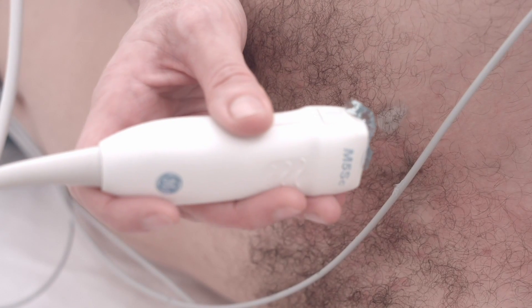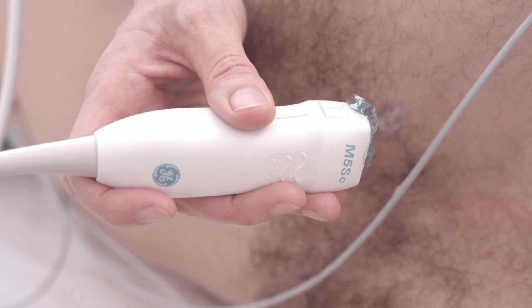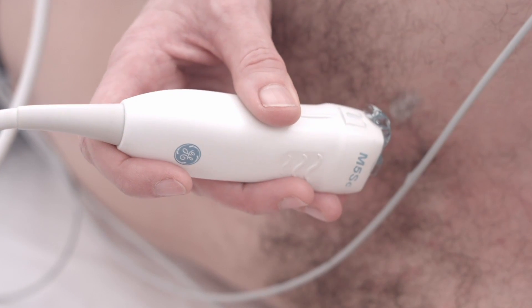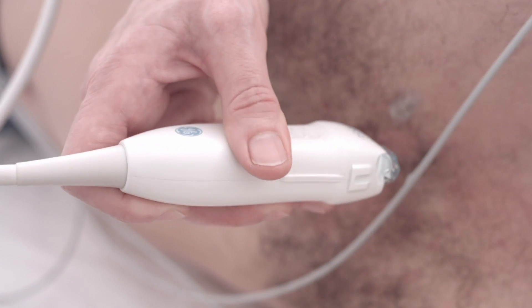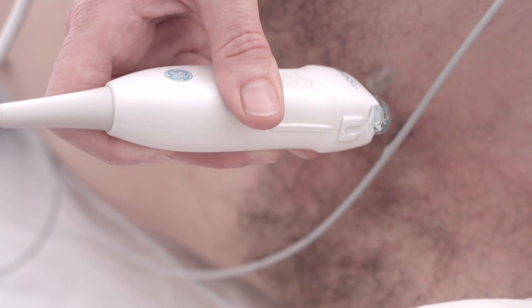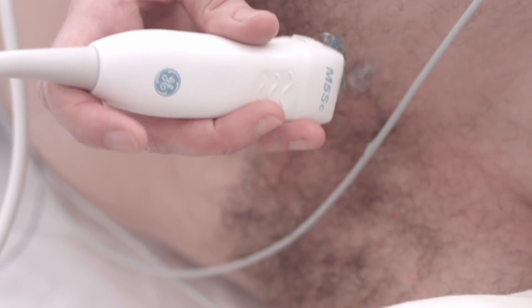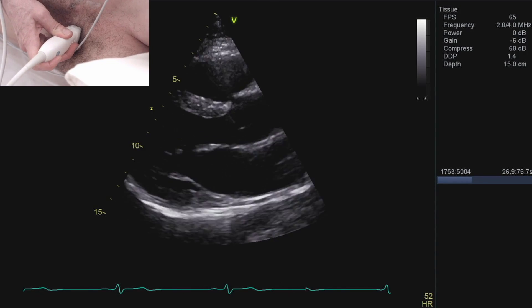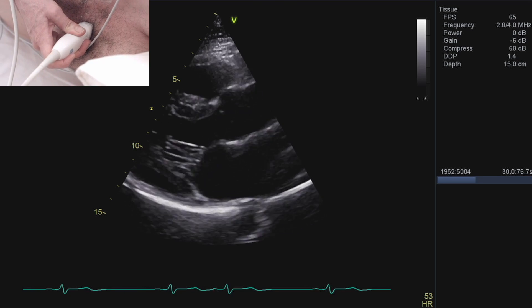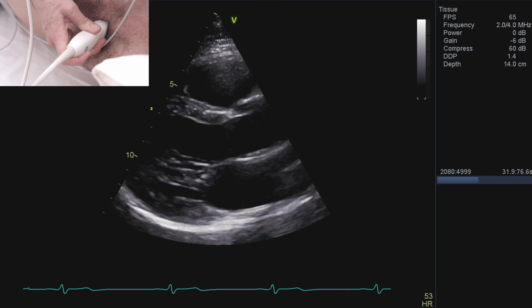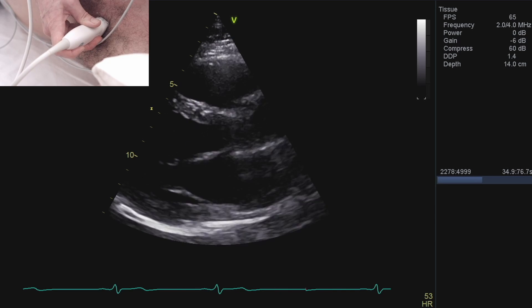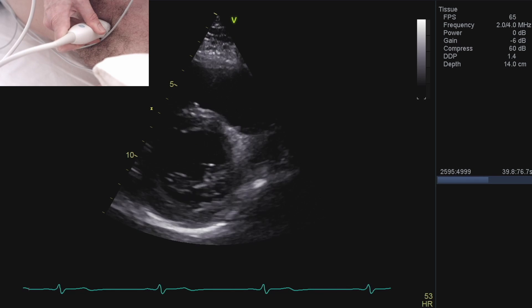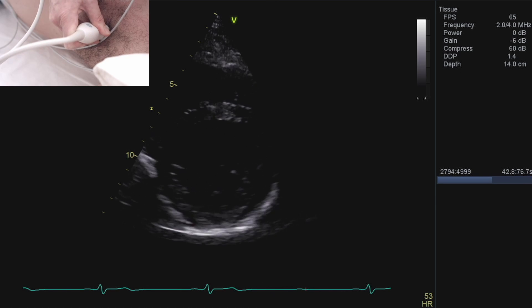So now we're going to scan in the parasternal short axis views. Whereas my notch was pointing towards my patient's right shoulder in the long axis views, I'm now going to rotate my probe round so that it's pointing at the left shoulder. I usually start back in the parasternal long axis view, in the same position — fourth intercostal space, left side of the sternum — and then rotate round watching the picture on the screen, slowly rotating about 90 degrees so that I'm pointing at the left shoulder.